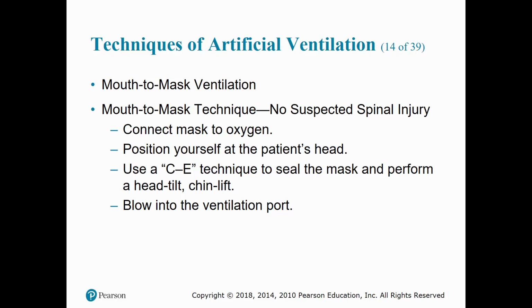Place the mask on the patient's face, and the narrow top portion of the mask should be seated on the bridge of the nose, and the broader portion should be seated in the cleft above the chin. You will then hold the mask with the CE technique, placing your thumbs on the top and lateral edges of the mask, thumb sides of your palms along the sides of the mask, and your index fingers up over the bottom of the mask over the cleft above the chin. In this way, your thumbs and index fingers form C's around the mask chimney.